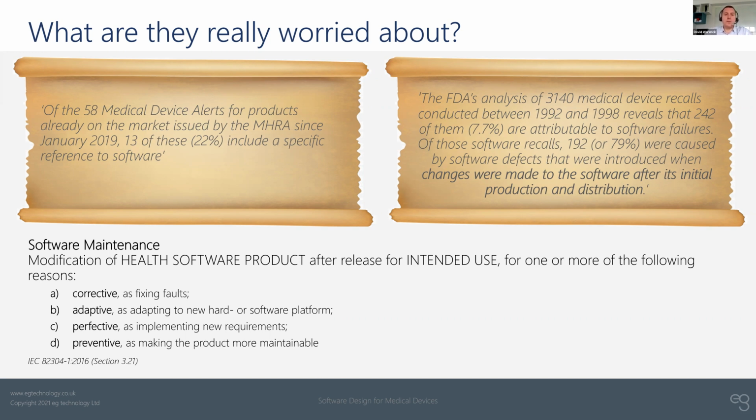And so this kind of area is becoming under increased scrutiny from two particular aspects, both in terms of looking at cybersecurity, which we'll think about in a second, and the potential implications of forthcoming software which is based around machine learning and AI as well.